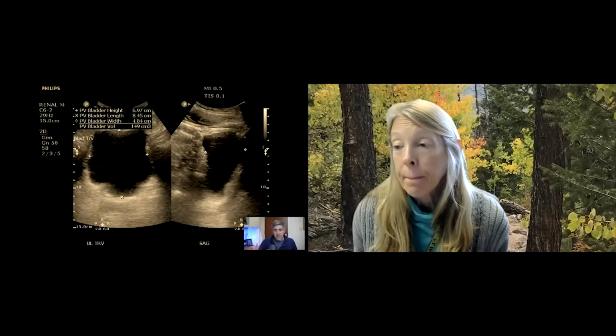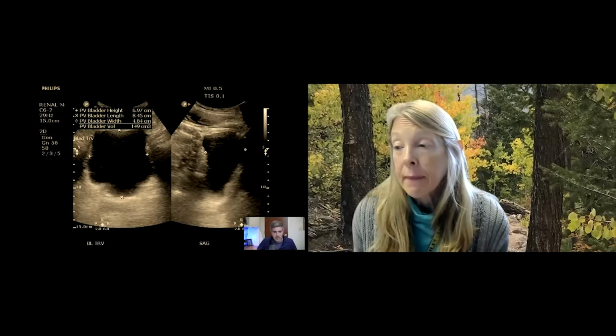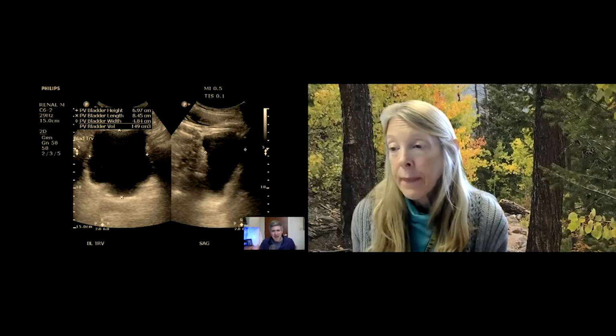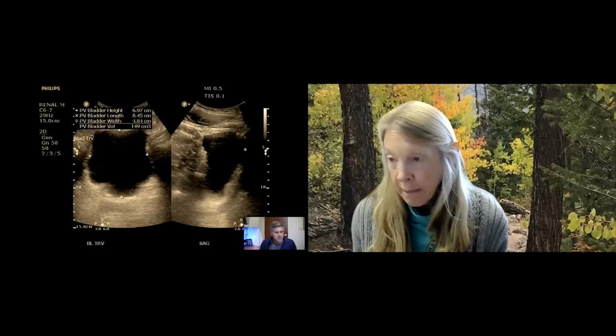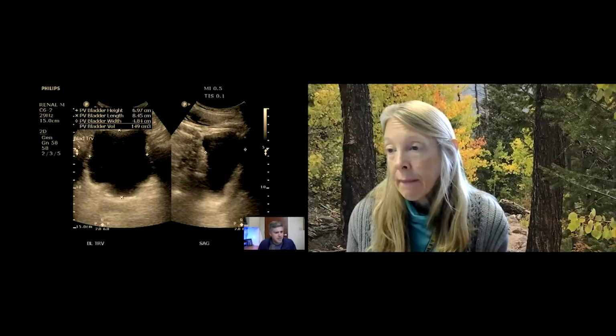Compare that with echogenic fluid, like purulent material, which has things that reflect those sound waves, so that may not be anechoic. But urinary fluid, urine, is going to be anechoic. And so the bladder is going to be this black hole, right? It will sonographically appear in our transverse orientation as a boxy shape. If you can see on the left-hand side of that screen, it's a box with rounded edges essentially. And in the sagittal, or vertical, orientation, it's going to have that cone-shaped appearance. You can almost imagine that triangular appearance of the bladder in the sagittal orientation.